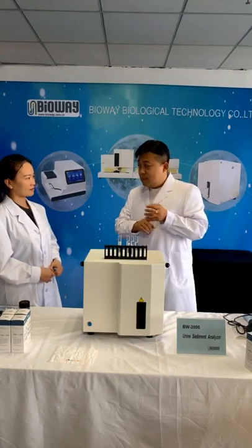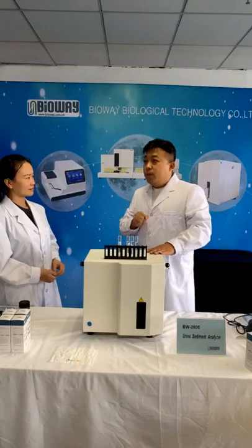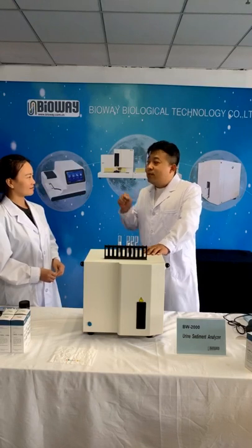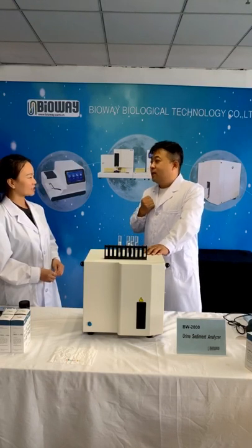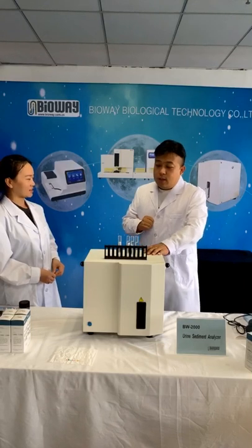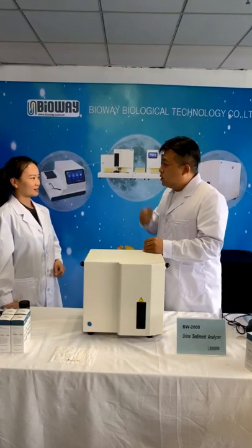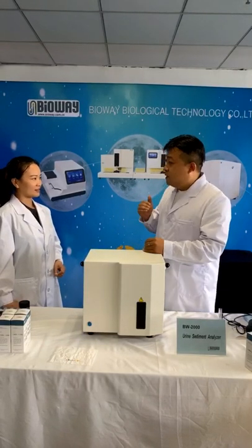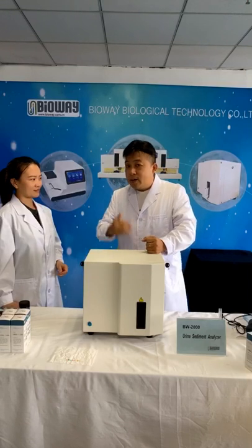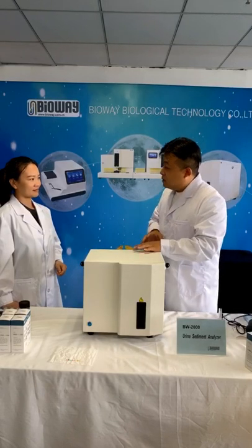The 40 lens and 20 lens have very different ranges. It is a four times difference. For example, if the 40 lens finds 10 cells, the 20 lens should find 40. So the difference in the result should be four times, right? Normally in the urine sediment analyzer, the 20 lens range should be bigger than the 40 lens. Exactly, so now we can get the idea.